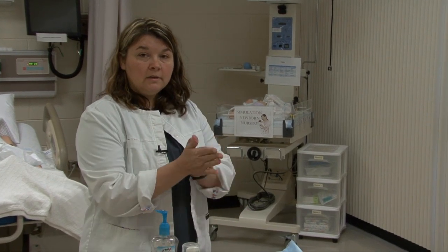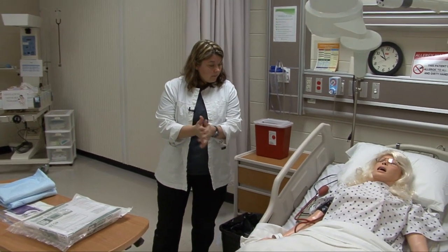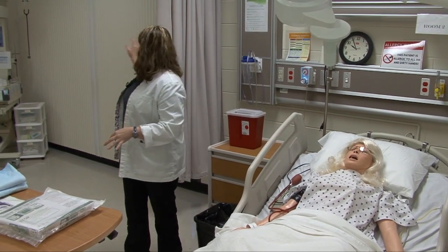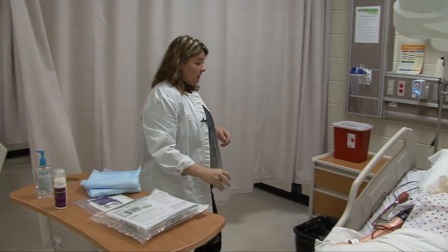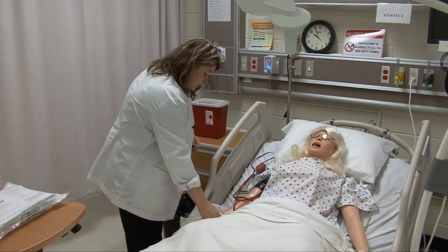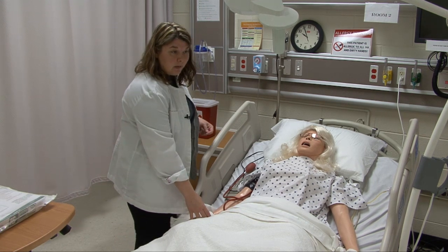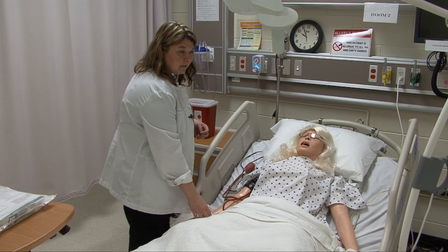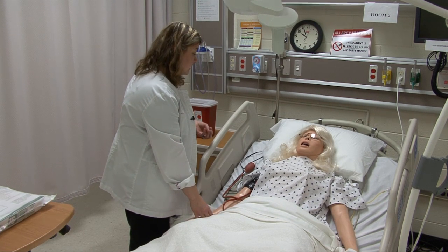Now I'm going to enter the patient's room. As I'm entering, I'm going to knock and foam as I enter. Good morning, Mrs. Smith. My name is Heather. I'm here to do a catheterization on you this morning. I'm going to pull the curtain for privacy. Mrs. Smith, I'm going to check your armband — please tell me your full name and date of birth. I've acknowledged the patient, identified the patient, and I'm going to explain the duration and explanation of the procedure.